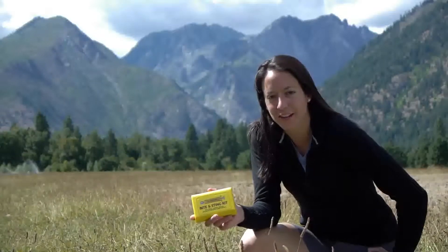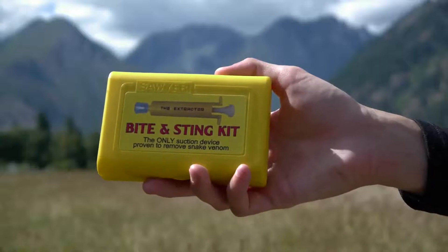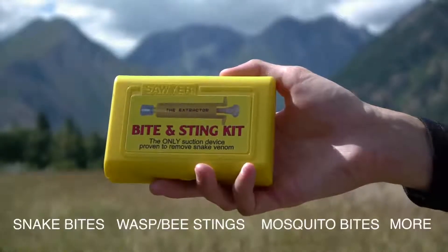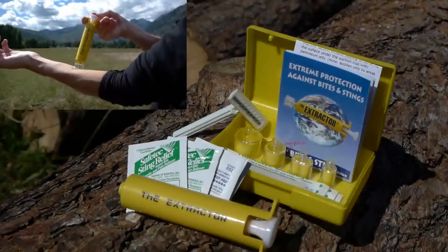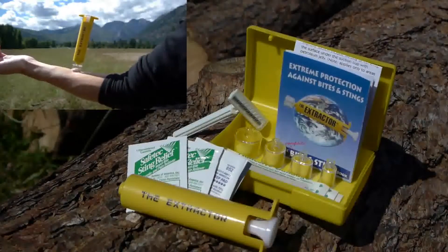Sawyer's very first product in 1984 was the extractor pump kit. The extractor pump removes poison from snake bites, wasps and bee stings, mosquito bites and more. The pump acts as a vacuum which provides the most powerful suction available to remove venom from the body by sucking it out the same cavity through which it was injected.